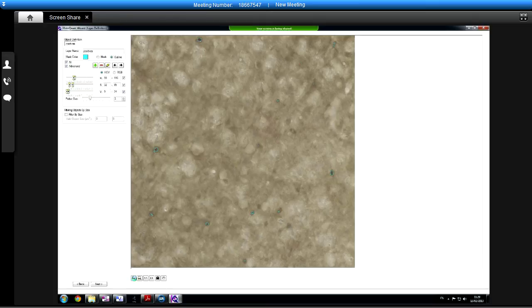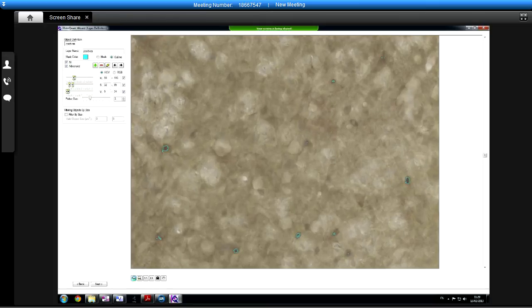So the other thing you see under advanced here is the picker size. So this affects, if you think of this picker as just like in Photoshop, you know, like a what do you call it, a syringe thing, this is just the size of that. So if you're trying to mark really little things, then put that down a bit. If you're trying to mark quite big things, and they're such a different colour from everything else that precision isn't that important, then put it up a little bit.